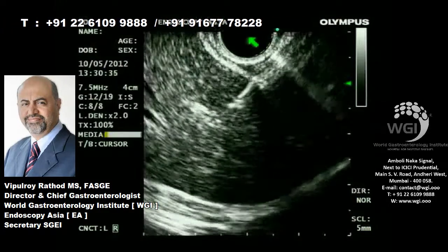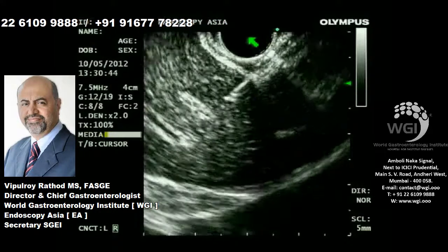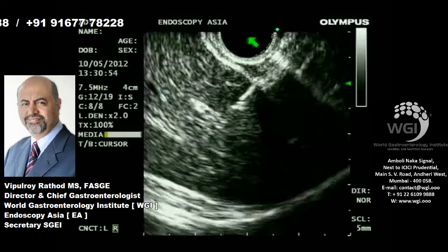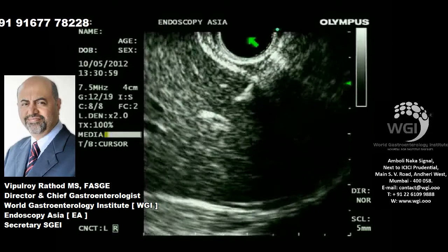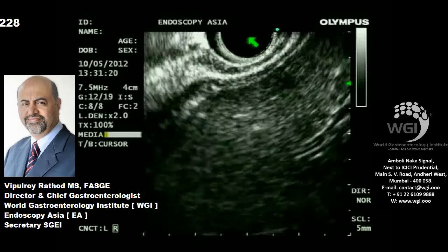Very gentle maneuvering can yield effective tissue diagnostic material, and this patient did have metastatic neuroendocrine tumor in the liver. So EUS FNA has a role in liver metastasis.